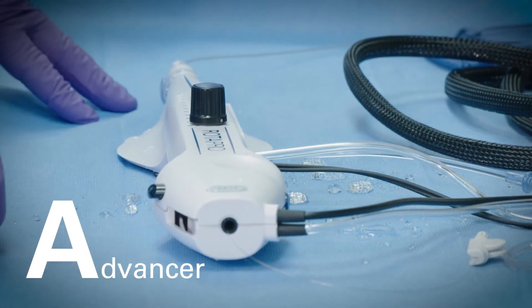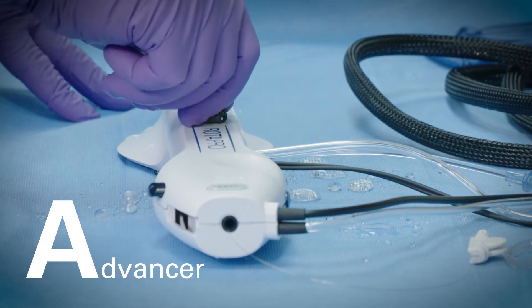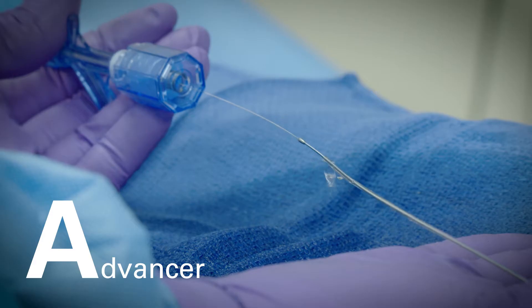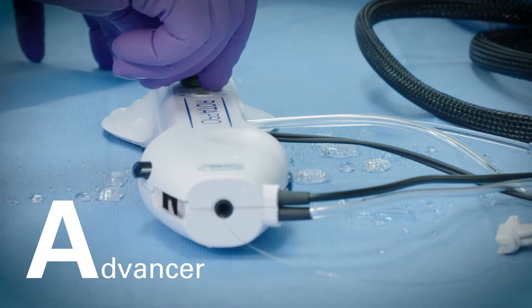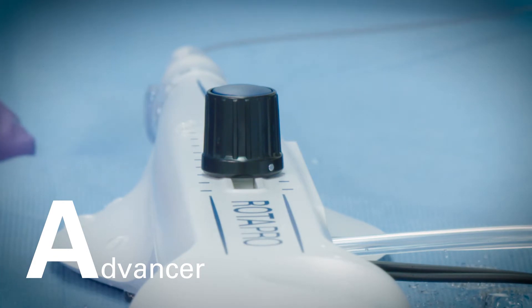A: Advancer. After setting the speed adjustment to give the burr proper rotation speed, practice advancing the burr while it is rotating. Slowly push the advancer knob forward and note the corresponding advancement of the burr along the guidewire to ensure free movement. Lock the advancer knob approximately 2 centimeters from the end of the advancer.